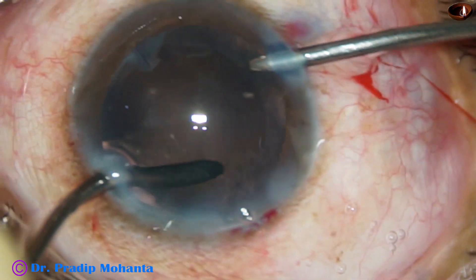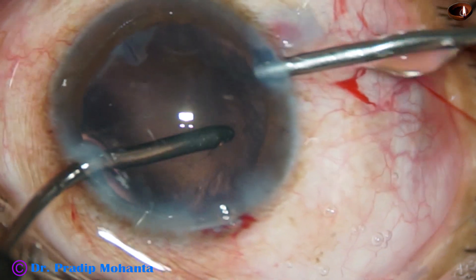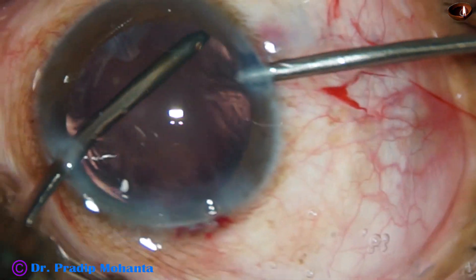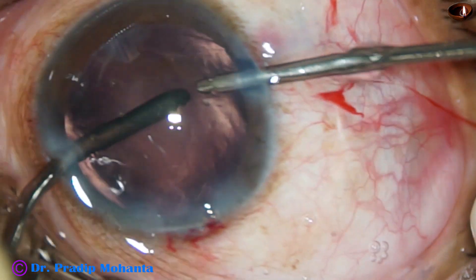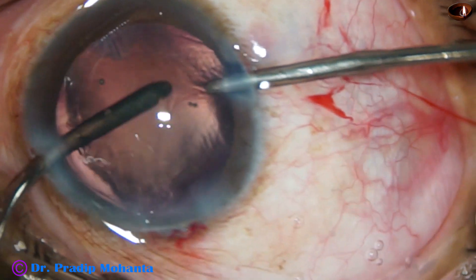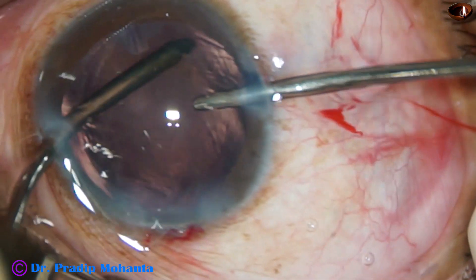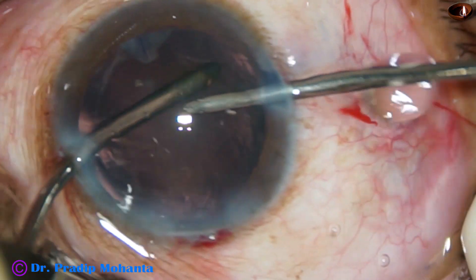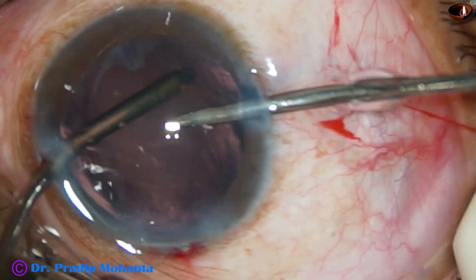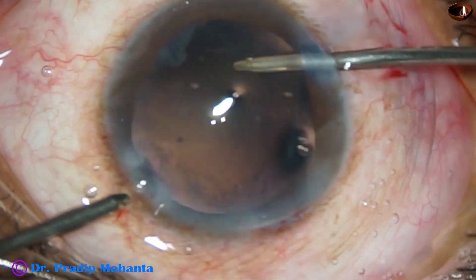Cortical cleanup is done with bimanual irrigation-aspiration in IA2 mode — vacuum is very low at about 50 and flow rate is 20. With very low vacuum I am polishing the posterior capsule, catching the cells over the posterior capsule and removing them.